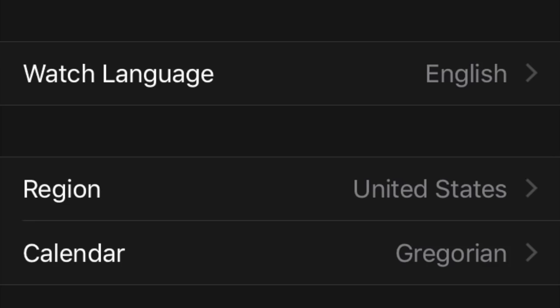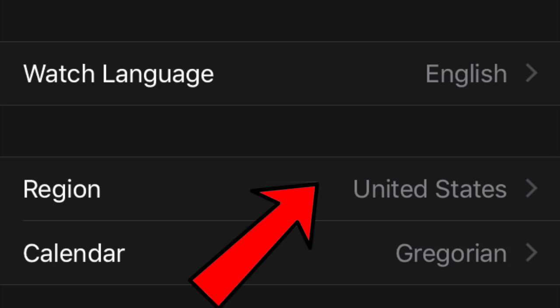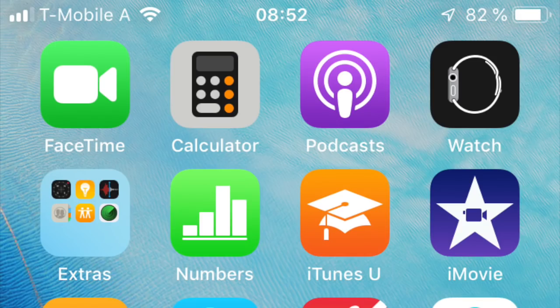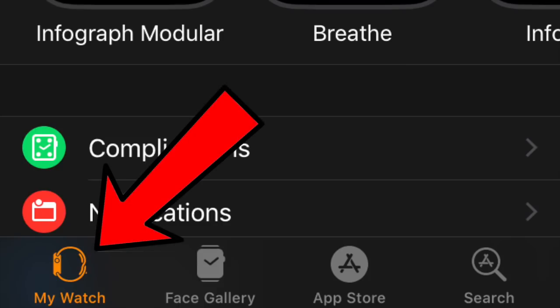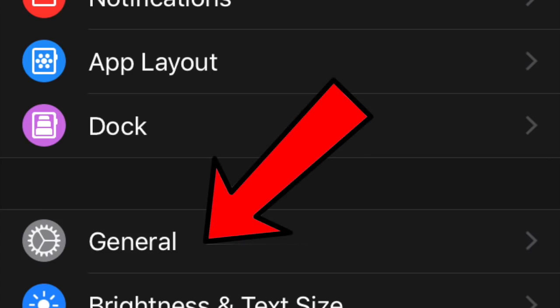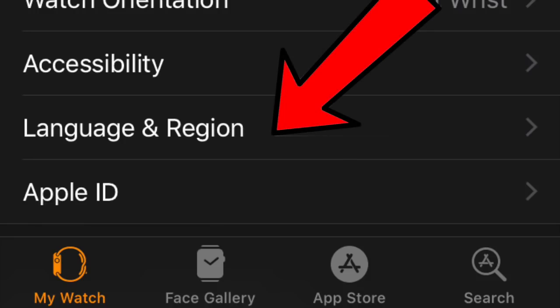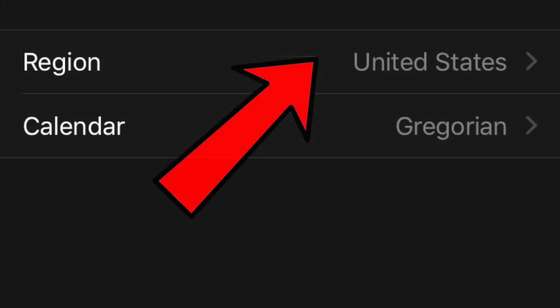To change this, simply change your Apple Watch region setting to United States. To do this, go to your Apple Watch app on your iPhone, tap My Watch, then General, then Language and Region, and change the region to United States.